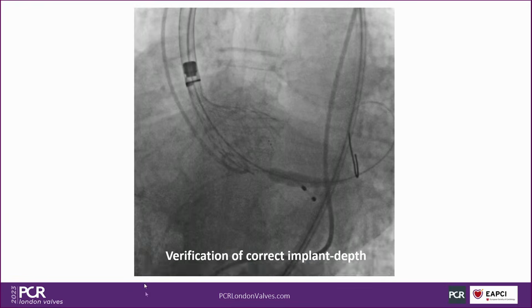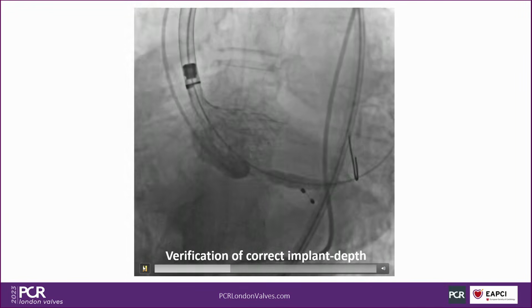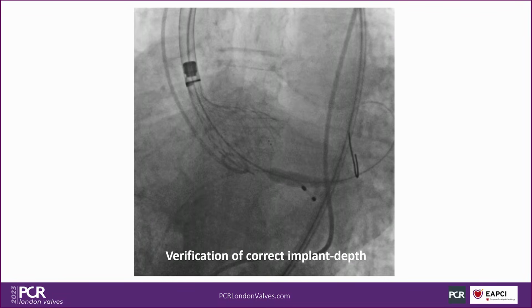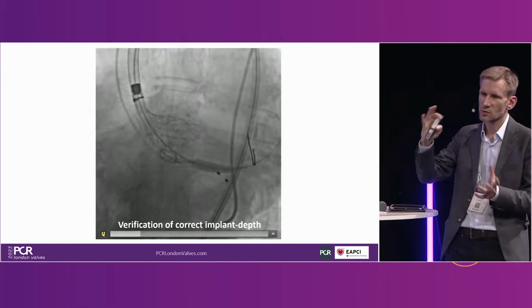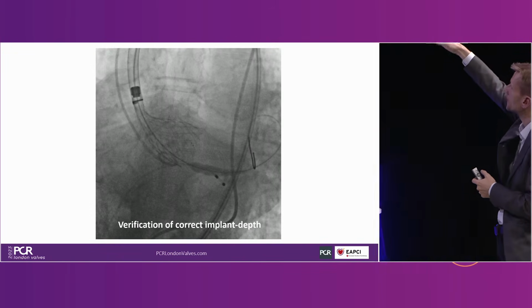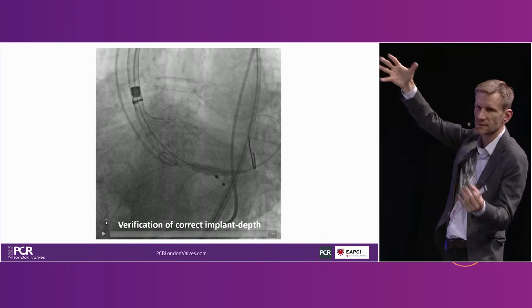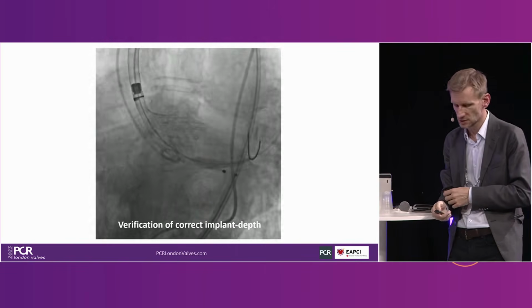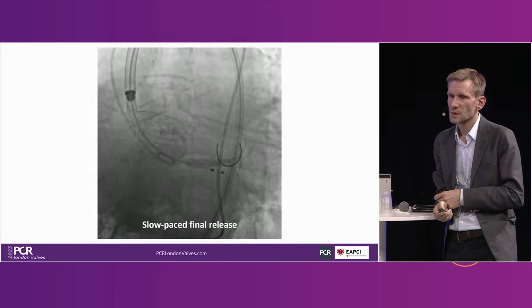Yeah. And already, Ole, it's actually pretty impressive on the left side, right? The left side is not super deep. No, but it's not super deep. Yeah, it's good, more symmetrical. It's around much more coaxial, huh? 3.2, and you have maybe 4 millimeter more. Indeed, that's something that I appreciate, that it's kind of more self-centering. That's due to the flexibility of the catheter, of course. If the catheter is more flexible, you can get this valve which orients itself more spontaneously central into the aorta. There was a cusp overlap.